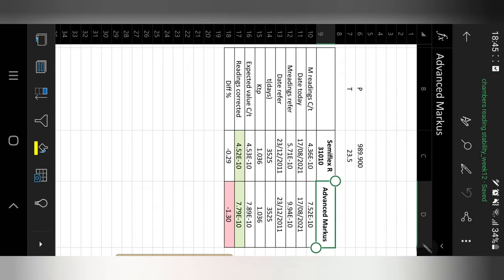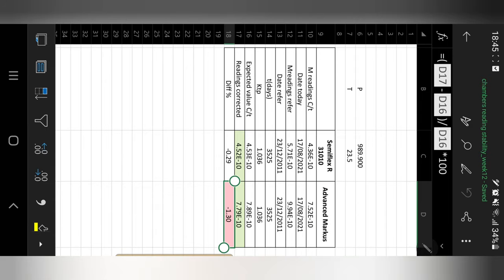We expect these chambers to be stable and within 1% — in other words, the difference between the expected value and the corrected reading should be within 1%. However, we are seeing a higher value for the Advanced Markus at 1.3%, so we are going to follow up to see if this chamber needs to be worked on or whether it could be an error in today's measurements.